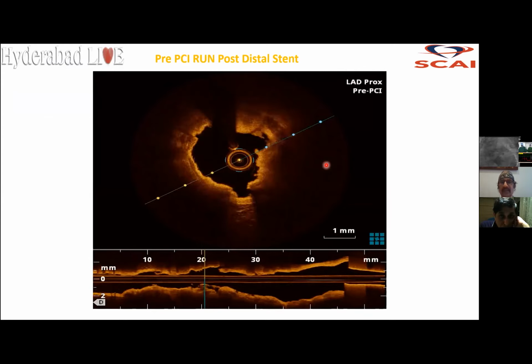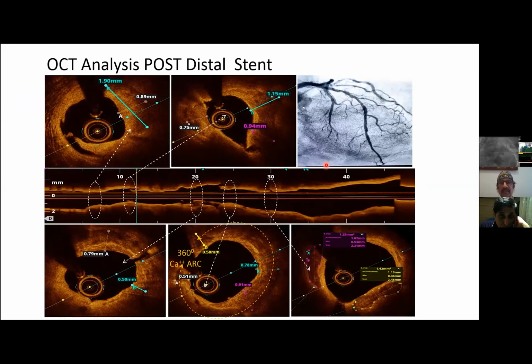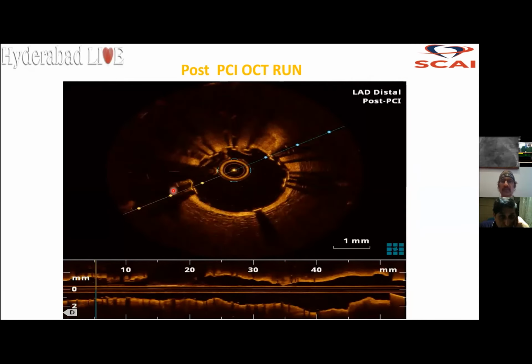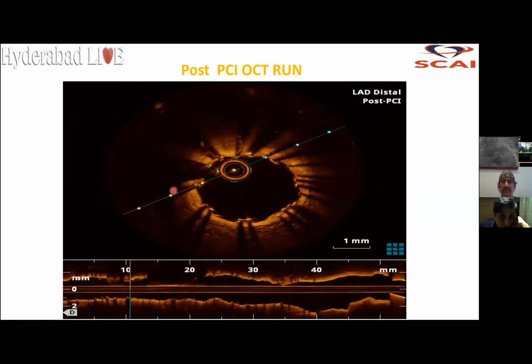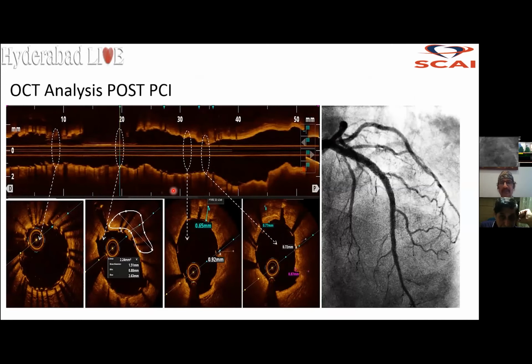with calcification. And OCT is actually a great guide to decide where your calcium is located. Like if you are going to end your stent at a particular spot, let's say, and you see calcification here, maybe you should extend your stent length to cover that particular portion. OCT is, of course, also very useful post stenting to decide if the stent has expanded fully well. So there are lots and lots of issues which can be sorted out.